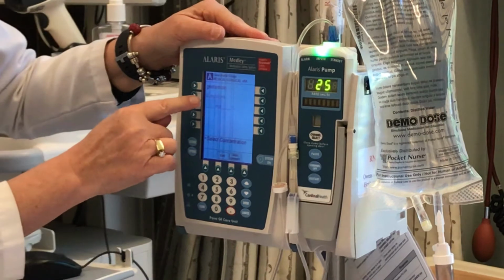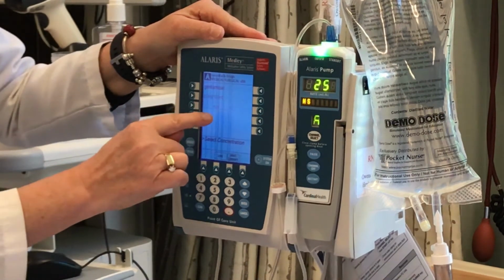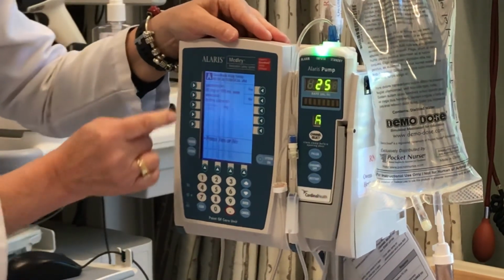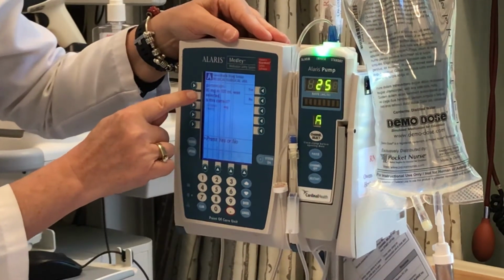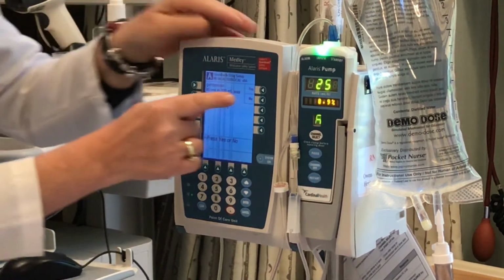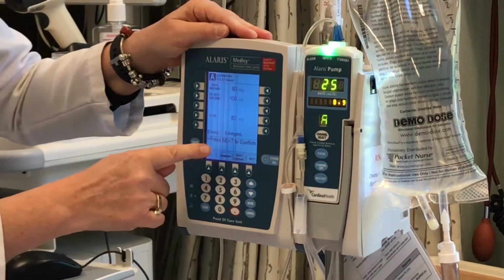Then again, it asks, is it 80 milligrams per 100 ml or is it a different concentration? Mine is 80 milligrams in 100 ml, so I select that choice. Now it asks again, are you sure that it's 80 milligrams in 100 ml? And I'm checking my piggyback and my MAR, and that is the correct choice, so I'm going to hit yes. It goes through it one more time.